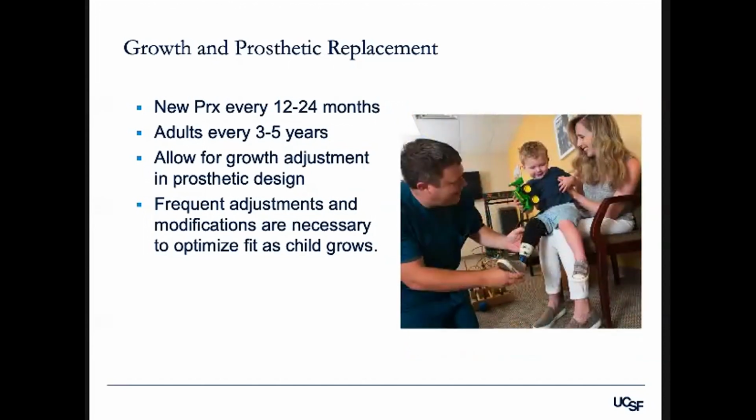And of course, as you can imagine, the prosthetist should always be consulted for modifications to the prosthesis to extend the device's usable life as the child grows and to accommodate any issues that might surface.